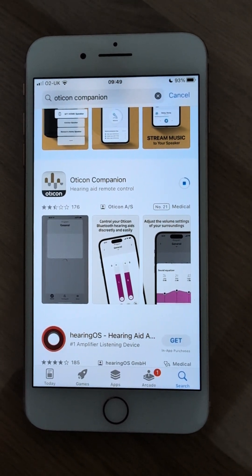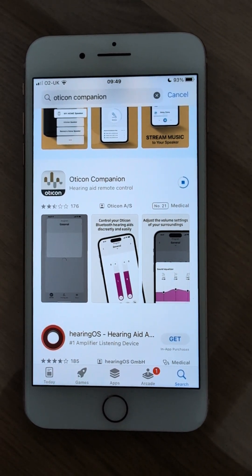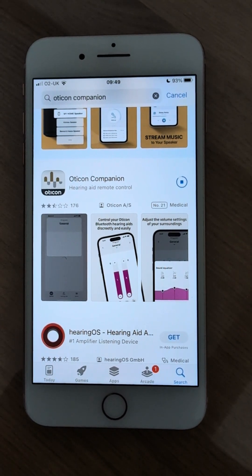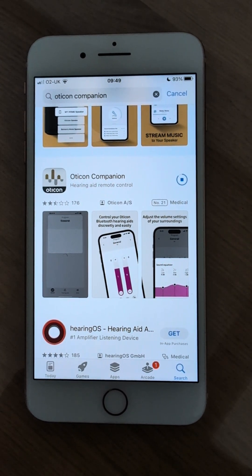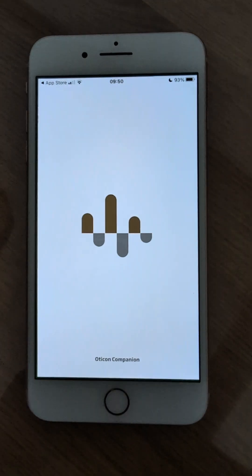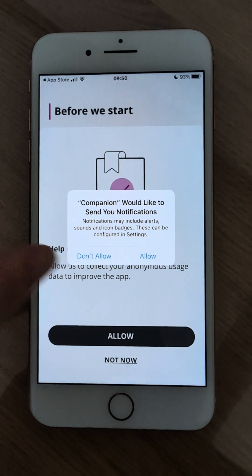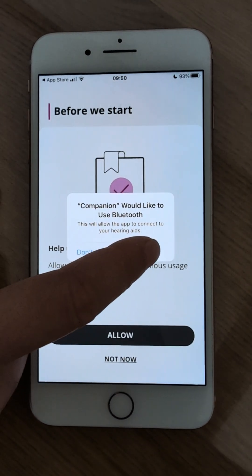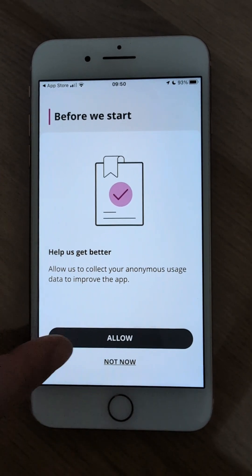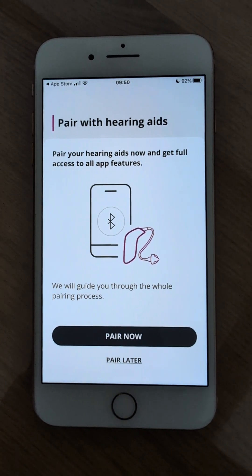Wait for the app to successfully download onto your phone. You're going to have the app load up onto your screen and you have to allow the various permissions for the app to work — notifications and Bluetooth. Whether you choose to allow app data usage is up to you. Now we're ready to pair your Oticon Intent hearing aids.